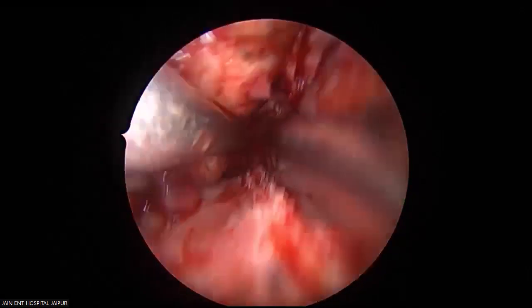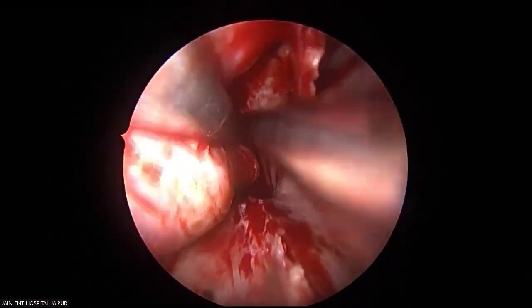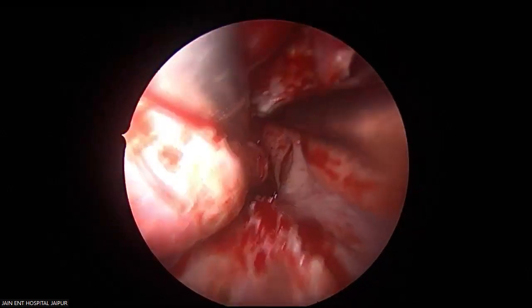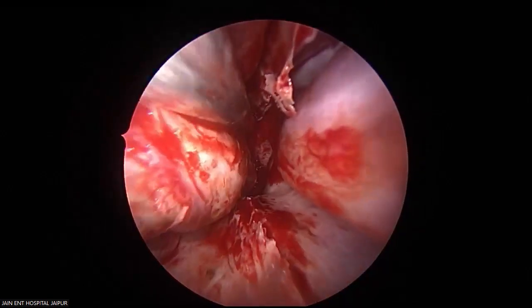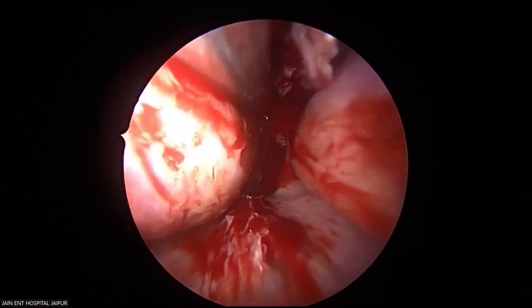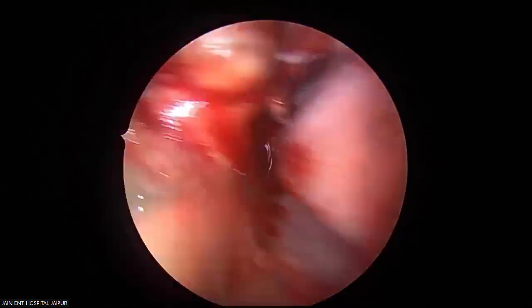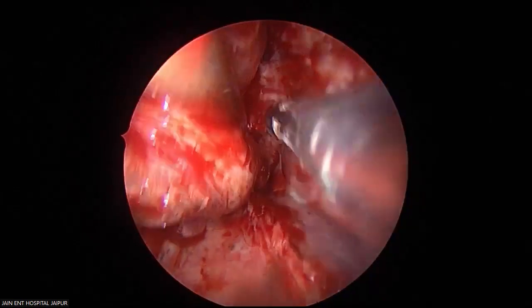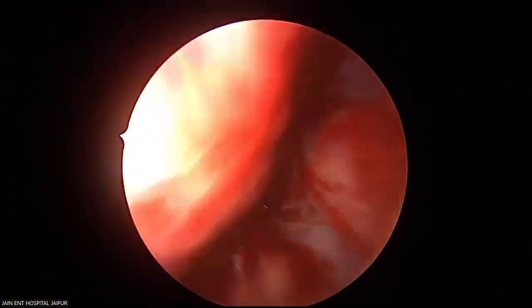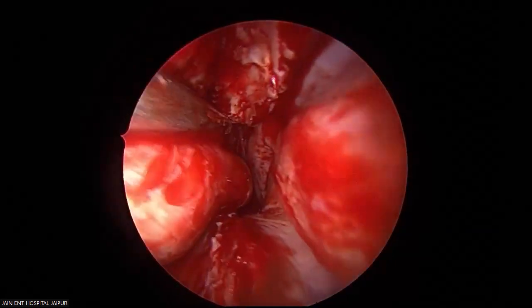Can you see I am in the nasopharynx? Yes. These medial attachments invite the blood supply from the opposite side very often. See this? Pharynx very clear.